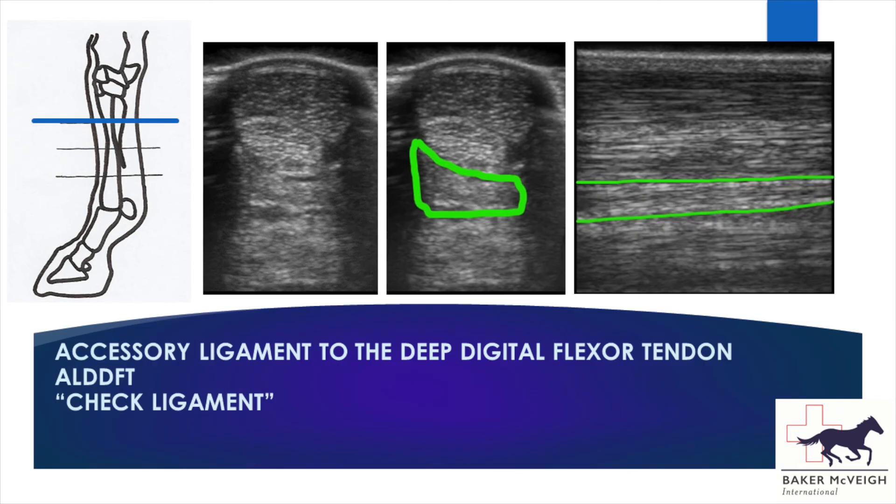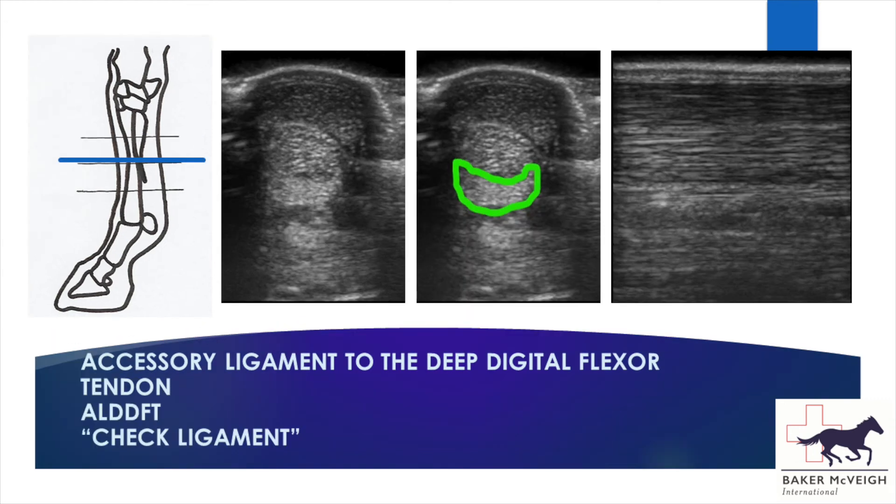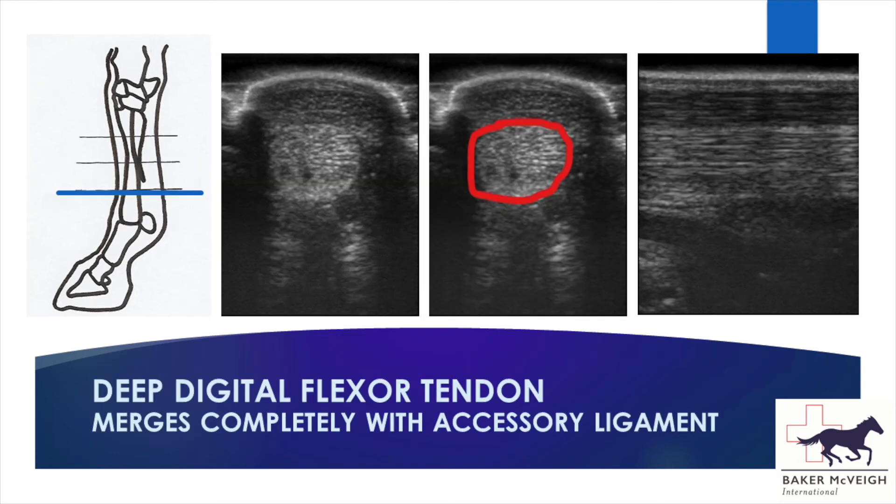Then the accessory ligament starts off as an irregular rectangular structure. As the ligament approaches the deep digital flexor tendon it becomes semi-lunar, wrapping around the deep digital flexor tendon until they merge to become one structure.